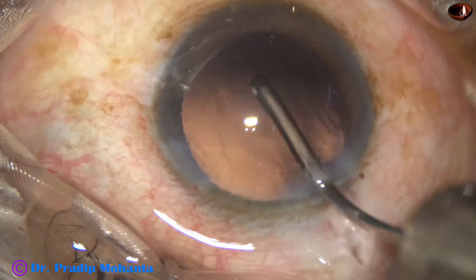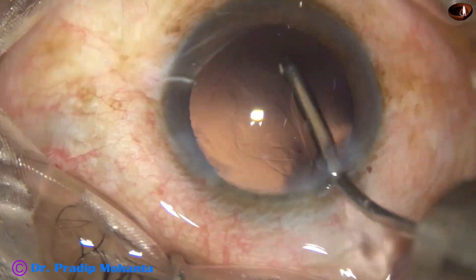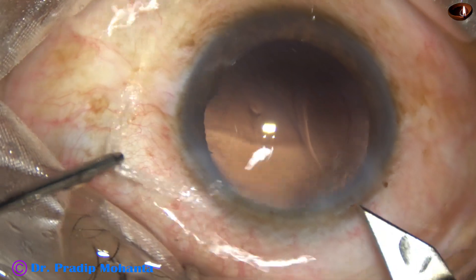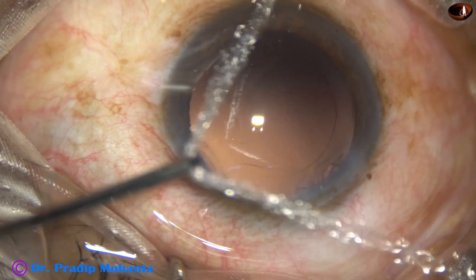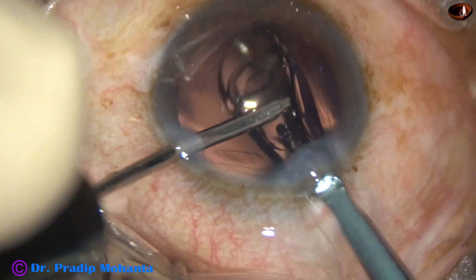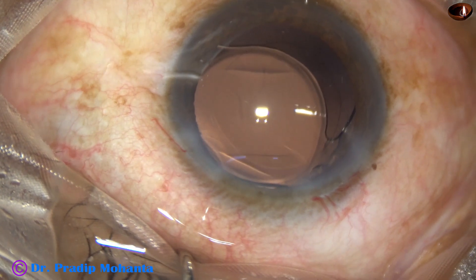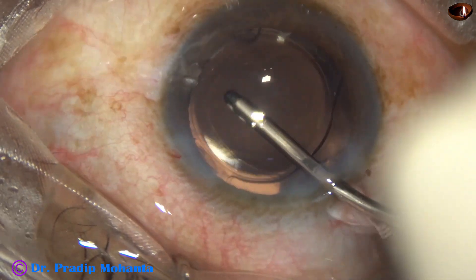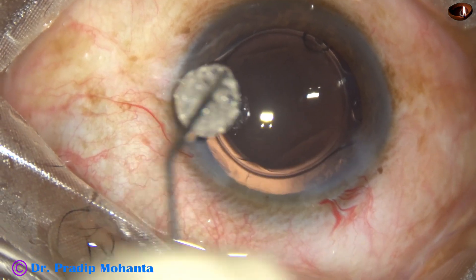The posterior capsule is polished by only the irrigating probe. We are now ready to implant an intraocular lens. In this case, we are implanting a hydrophilic acrylic single-piece foldable lens with the help of a B cartridge. The left-hand instrument depresses the haptic-optic junction and the lens goes into the capsular bag. Most of the time, we don't need a Sinski hook or dialer to place the lens.